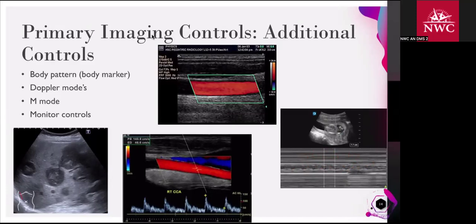And then monitor controls. Monitor controls are controls that are actually on your screen, on your monitor, and they allow you to change the brightness and the contrast of your image.